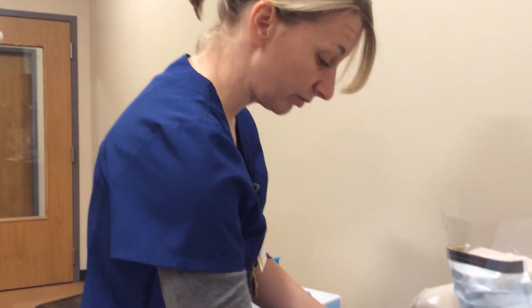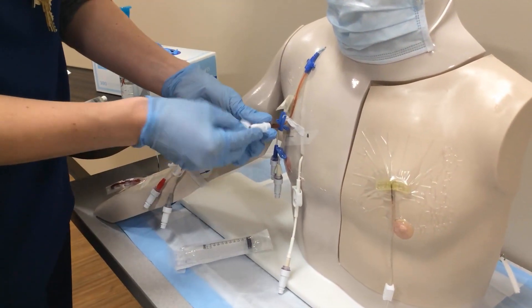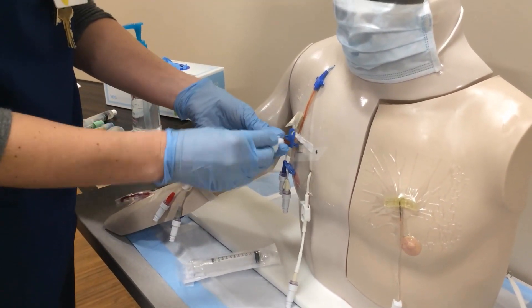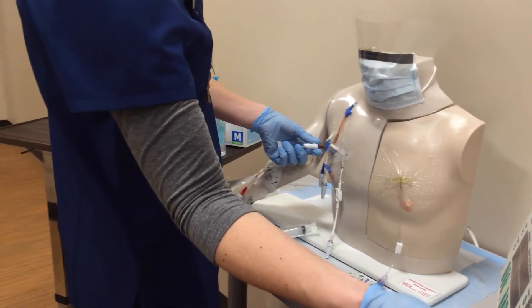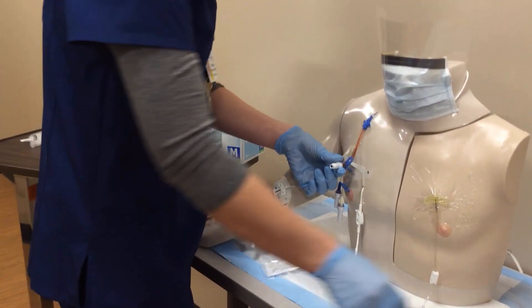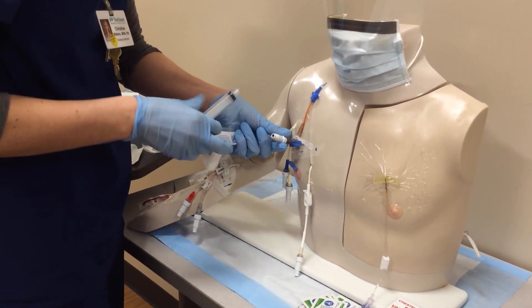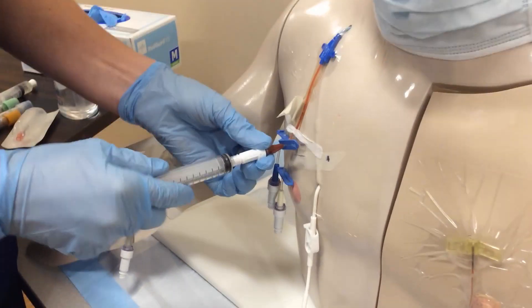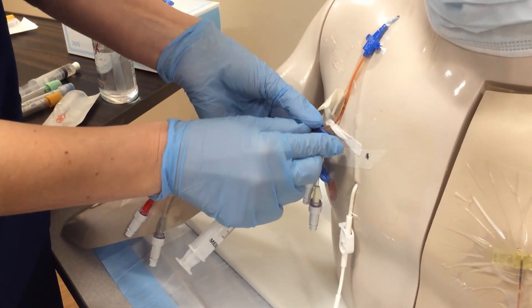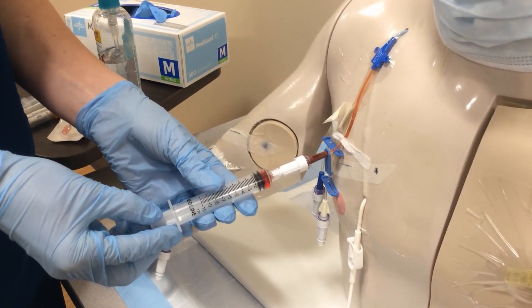Sometimes you will have lab at the bedside with you and you can hand that waste off to lab and they will dispose of it appropriately. I'm going to go back to cleaning the tip again — anytime I take something off and put something on, I clean it. I need to make sure I clean off the end of my line really well. Now this is my second empty 10ml syringe, which I'll use to draw back the blood I'm going to send to lab.